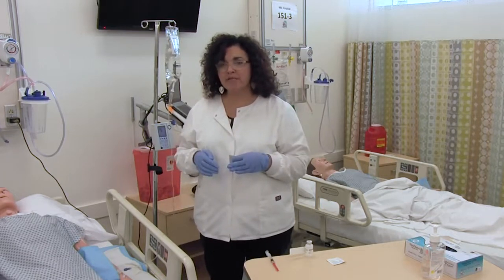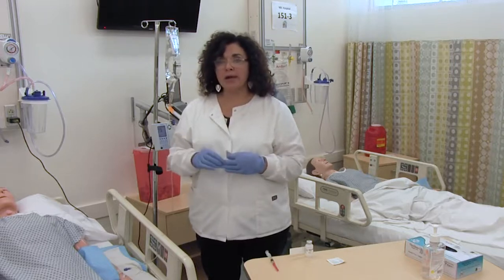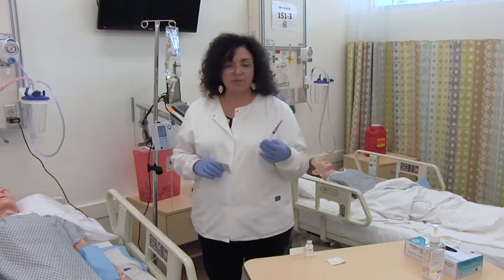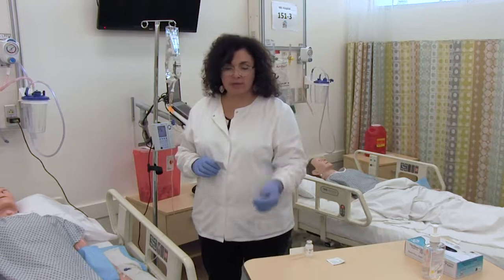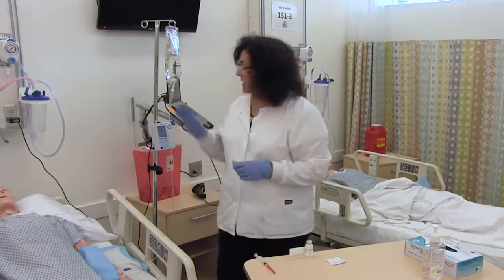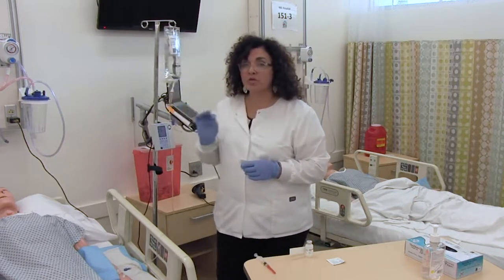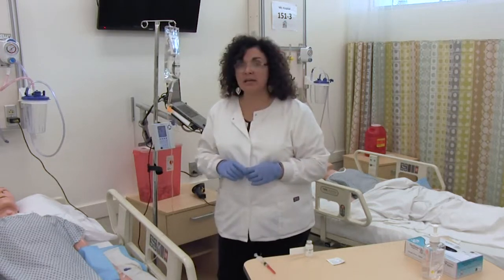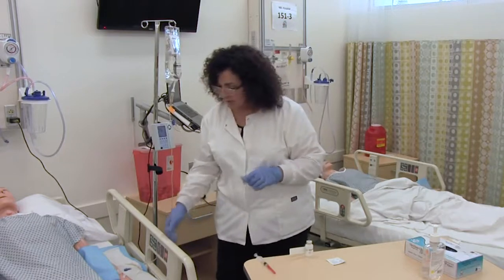The only time I need a flush is when I have an incompatibility, or when I have a very small volume of medication, and a small volume of medication is classified as 0.5 milliliters or less, or when I have a very slow primary rate, and that would be a rate of 50 milliliters per hour or less. In those cases, we would use a flush, but in this case, there's no need for any saline flushes, so I will have just my medication here.